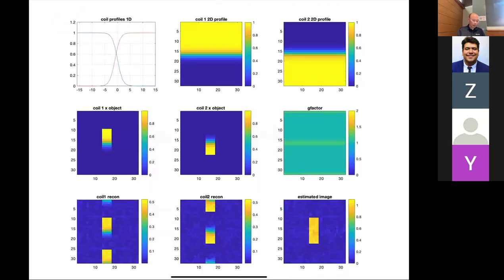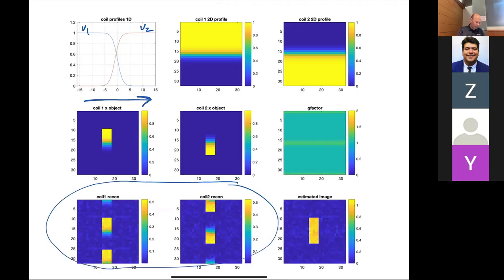Okay. So what you'll see in your homeworks and can play around with is what we talked about last time. So let's call this vector V1 and this is V2. If you think about these as vectors, across this dimension they look pretty different, right? So I go for my aliased images. These are aliased, right?